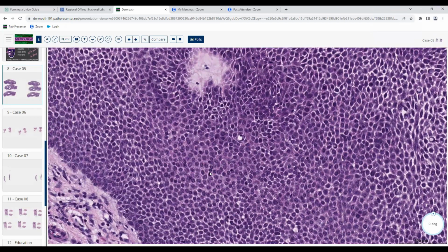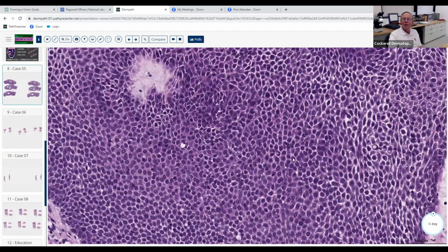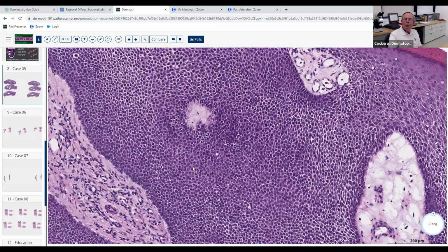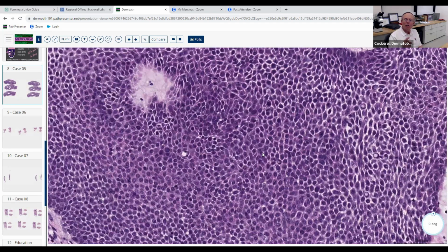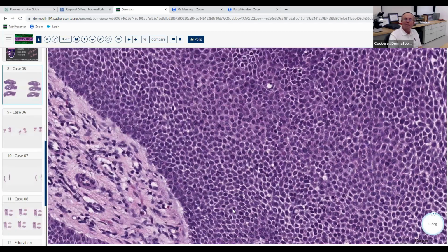In general, I thought so, yeah. Yeah, they do. They look almost like clones. These look almost like identical twins. They really look very, very similar, homogeneous morphology to these cells. And what cells give you these dark, small, cuboidal, basophilic cells with a high nuclear cytoplasmic ratio, and some cells that have maybe a little bit of glycogen in their cytoplasm over here, some of these clearer cells? What type of cell gives you that?